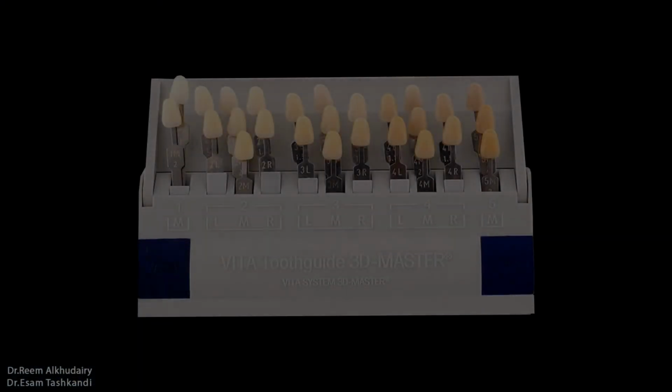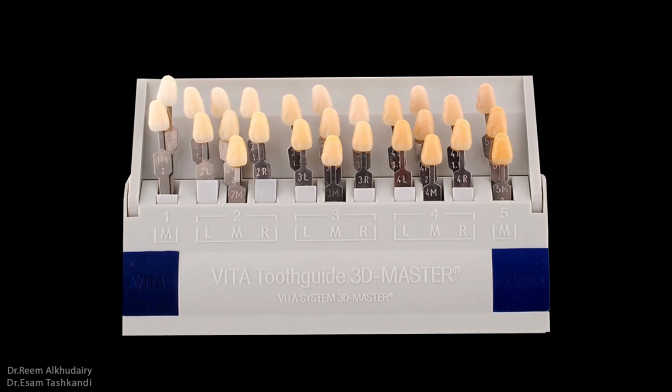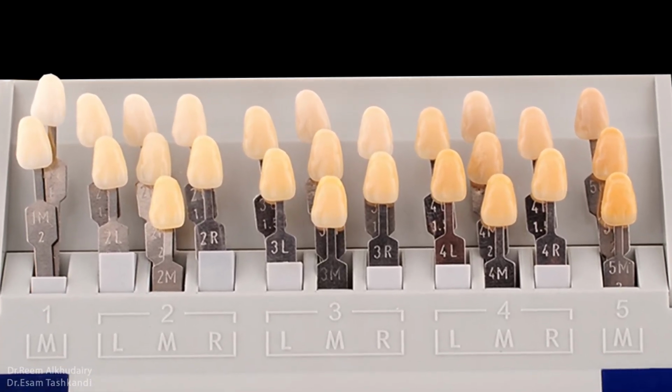Determination of the tooth shade is done in 3 steps using the guide. First, determine the value, lightness, by selecting the closest match from one of 5 value groups. Second, determine the chroma within the value group from 3 choices. Third, pick the hue by determining if the tooth has a more yellow or red cast. However, although this guide is based on a classification principle, it can be confusing and takes time to learn.